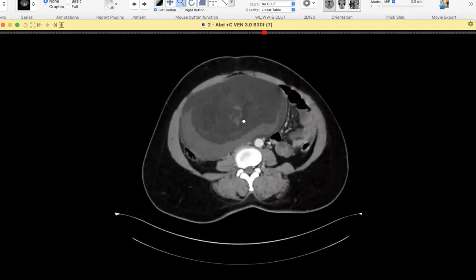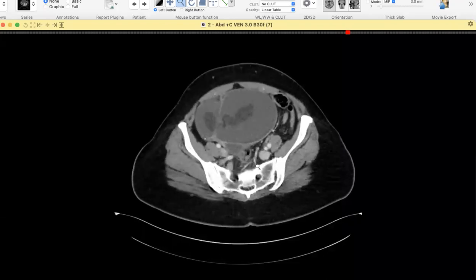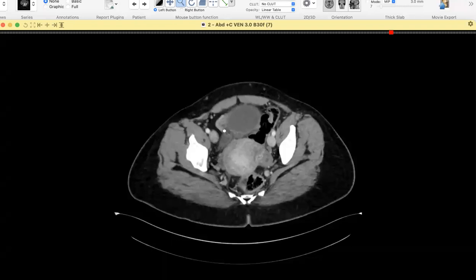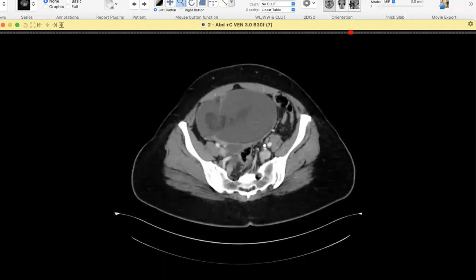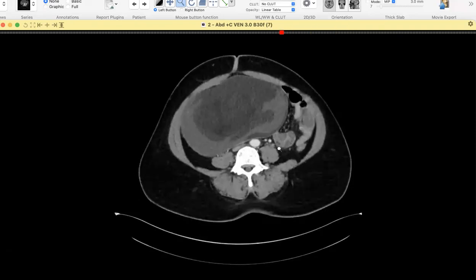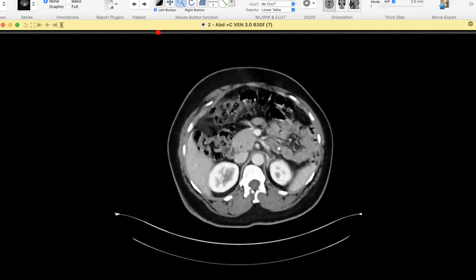However, very high possibility of torsion. So what would be more concerning over here is torsion. In fact, you have to rule out torsion whenever you see a dermoid. You have to evaluate the vascular pedicle to make sure there are no twists, enhancement, fat stranding. So these are the things that you should always look for when you see a dermoid. I think, yeah, that's good.